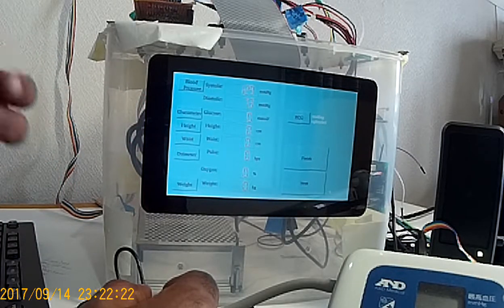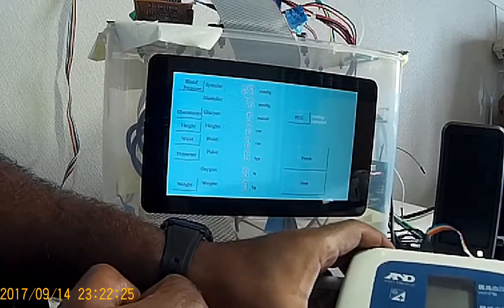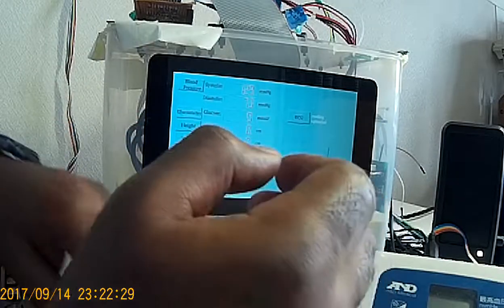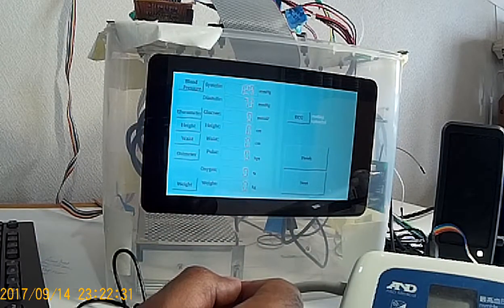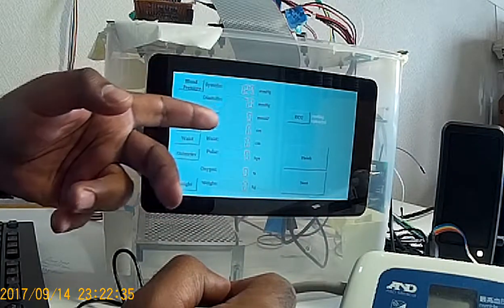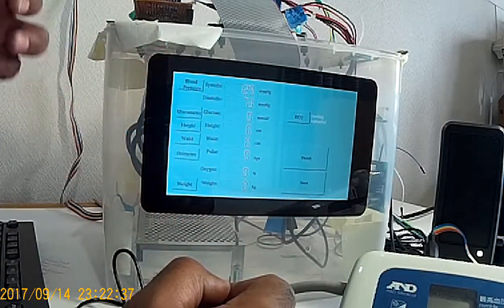Those medical devices are, for instance, standard certified medical devices, which we just inherit their precision into the EHealth kiosk. All we did is put the data properly and store it in the database.